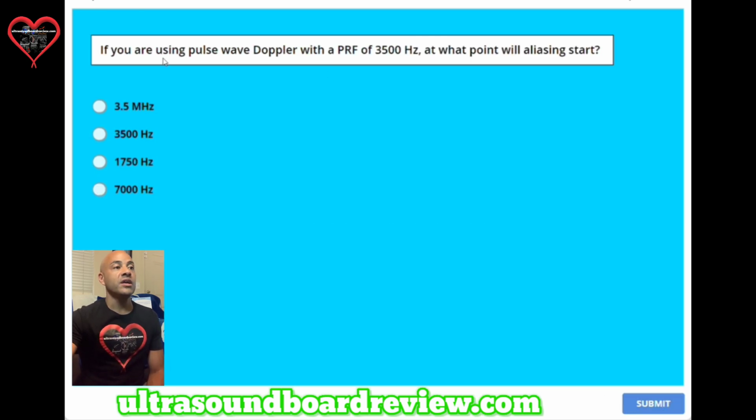Question 5. If you are using a pulse wave Doppler with a PRF of 3500 Hz, at what point will aliasing start? A, 3.5 megahertz, B, 3500 Hz, C, 1750 Hz, or D, 7000 Hz?